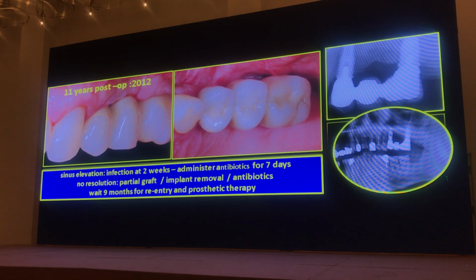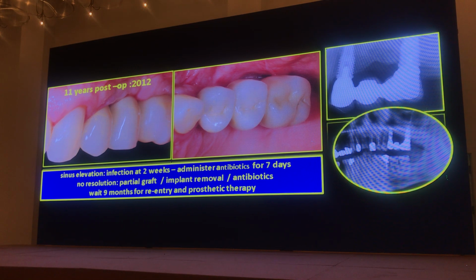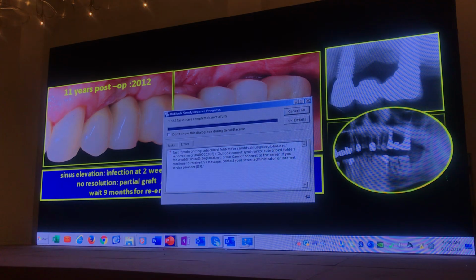The final outcome for the case, the other 2 implants were fine. The area in the center partially refilled with bone. And instead of regrafting it and making a big deal out of this, the treatment plan was changed from 3 separate implants to a bridge with a pontic where the infection was. So there was, again, no time lost, and everything worked well with a partial clean out.